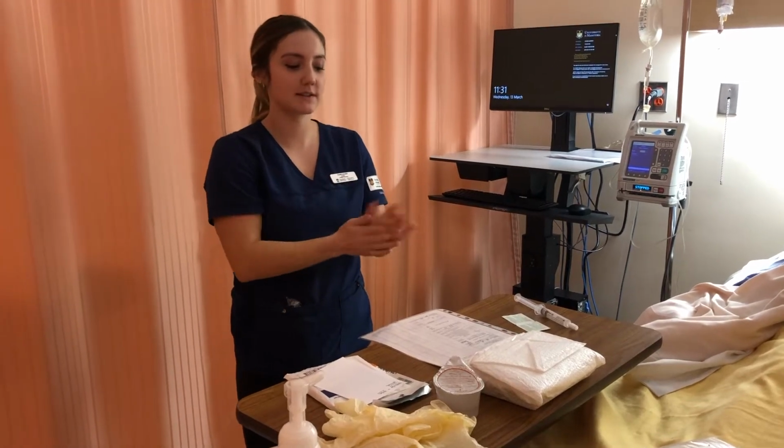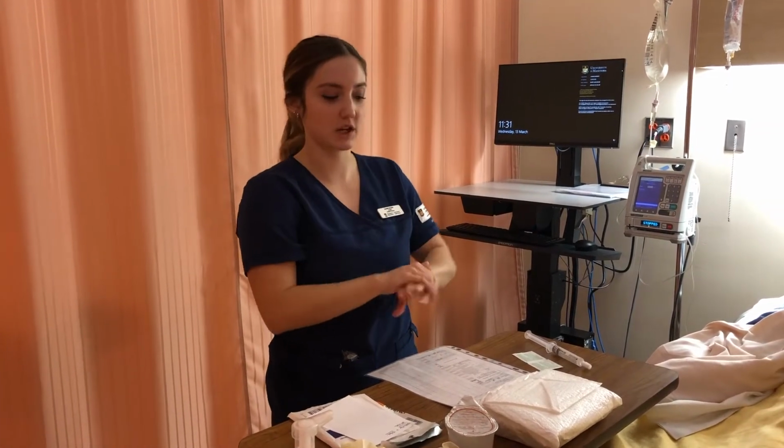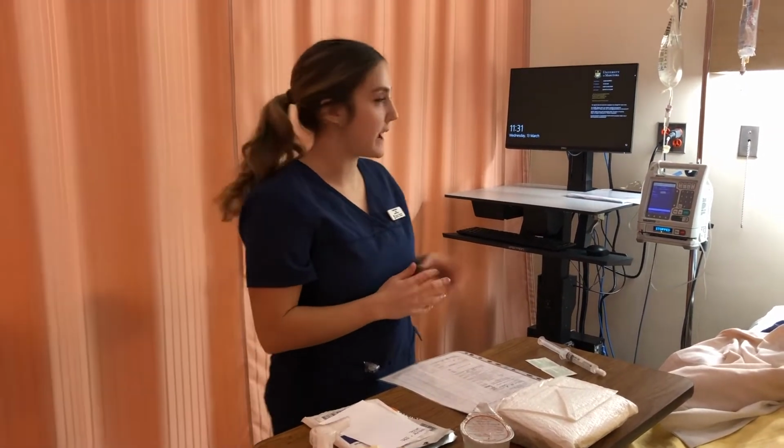My name is Tesslah. I'm a student nurse, and today I'm going to be showing you how to administer a heparin infusion that is already prepared by the pharmacy, as well as do a chest tube dressing change. So I'm first going to start off with my heparin.